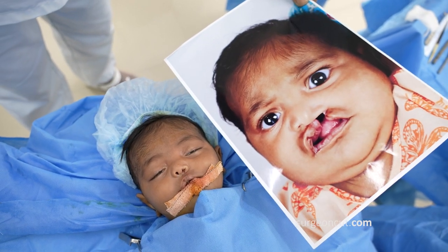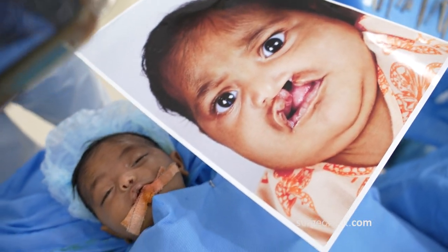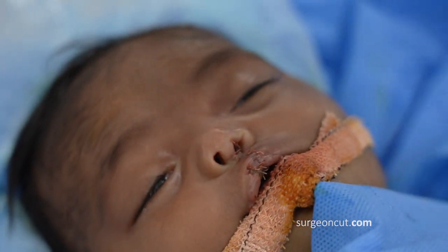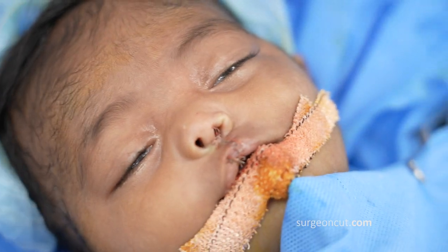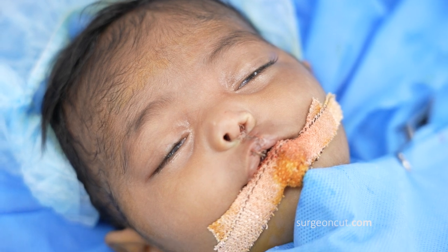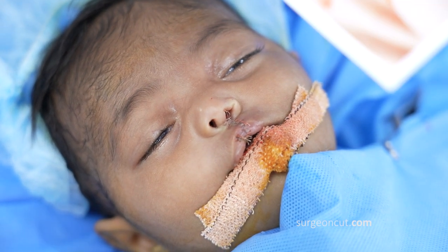I'm going to show you the close-up of the nasal symmetry, which is reasonable. It's almost symmetrical. I've got a nice Cupid's bow. The suture line I've placed on the philtral ridge, so it's not going to be as visible as if you don't place it there.